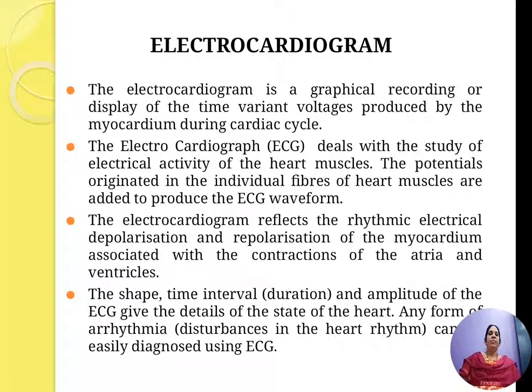Electrocardiogram. The electrocardiogram is a graphical representation, recording or display of the time variant voltages produced by the myocardium during the cardiac cycle. The electrocardiograph deals with the study of electrical activity of the heart muscles.